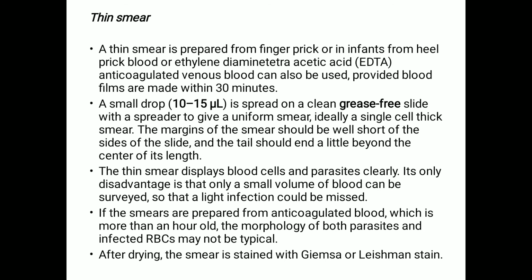Then coming to the next stain, that is the Leishman stain. Here prior fixation is not necessary as the stain is an alcoholic solution which fixes as it stains. Then this Leishman stain is applied for 1 to 2 minutes and diluted with twice its volume of buffered water. The pH will be the same, 7 to 7.2, and is kept for 10 to 15 minutes. The smear is then dried and examined.